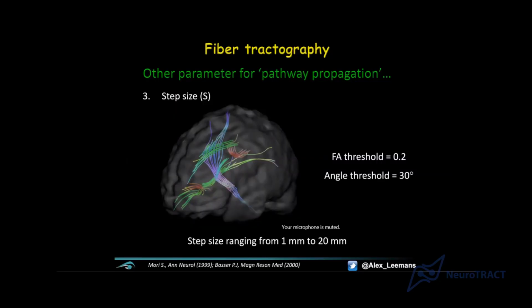Okay, there's a question about, is the voxel size something that we can modify? Does it even matter? Well, very good question. First of all, does it matter? Yes, it does, because a voxel size gives us the highest possible detail that we can look at. Think of it, again, I'm making the example with your phone and camera, right? Taking a picture.